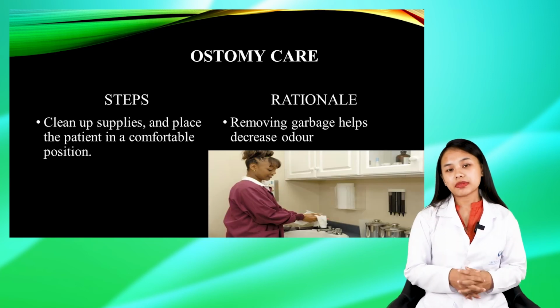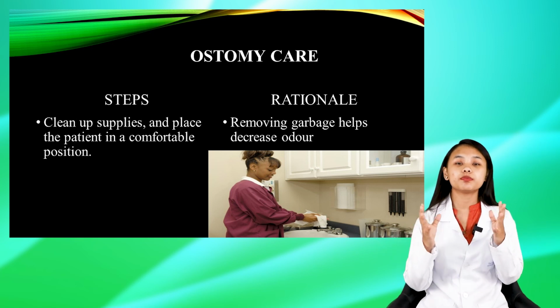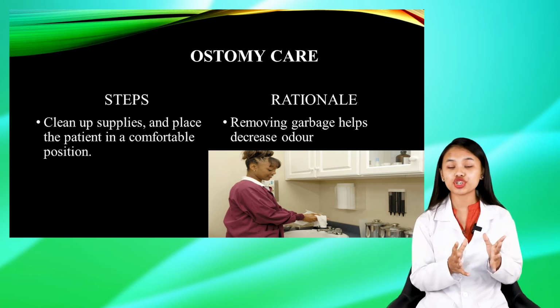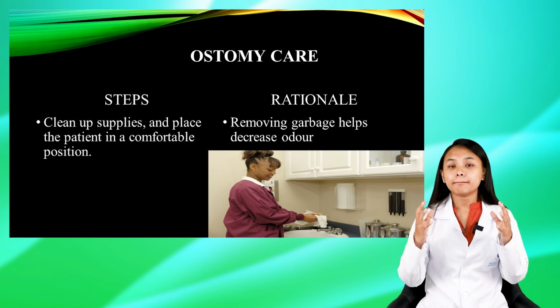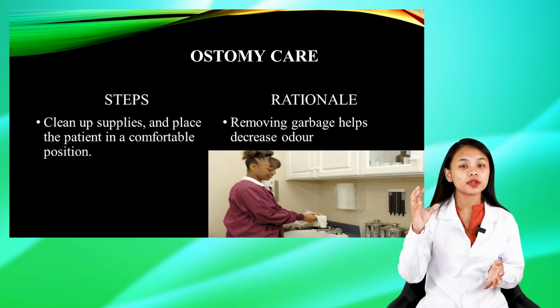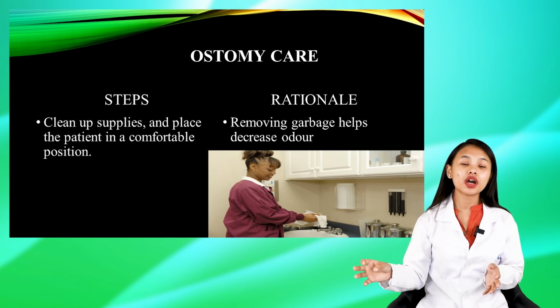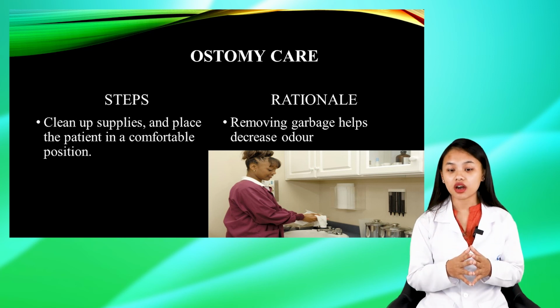After which we must clean up the supplies. We must place the patient in a comfortable position. We must replace all the articles in their proper places and also discard the ones that need to be discarded.